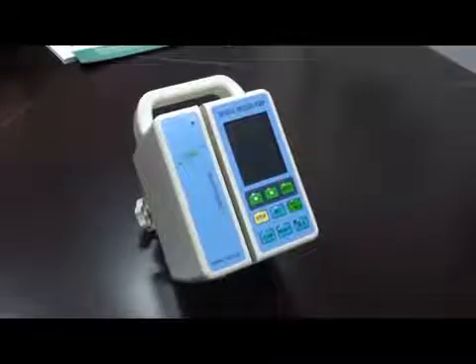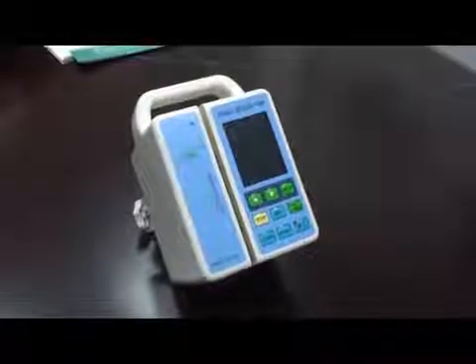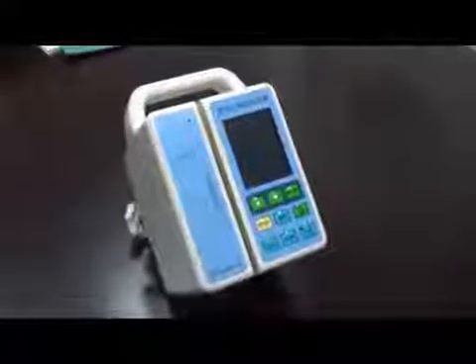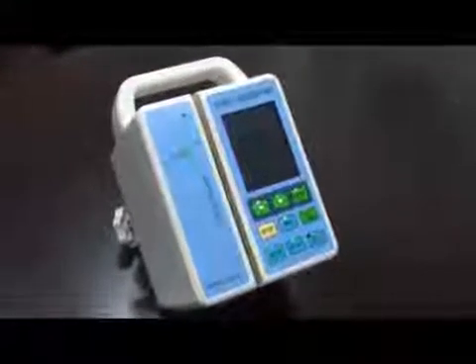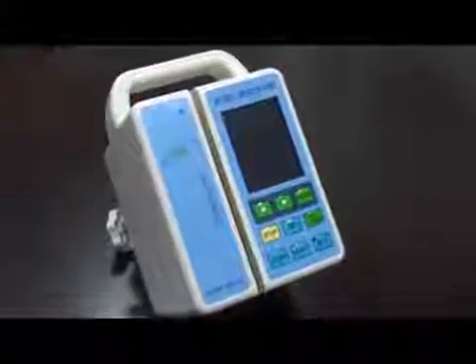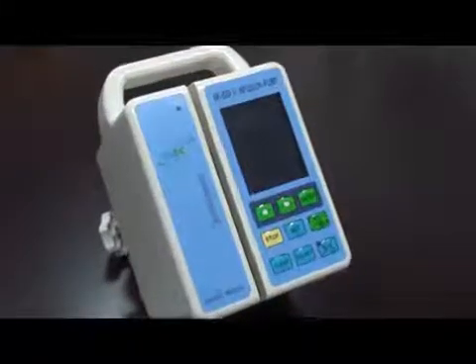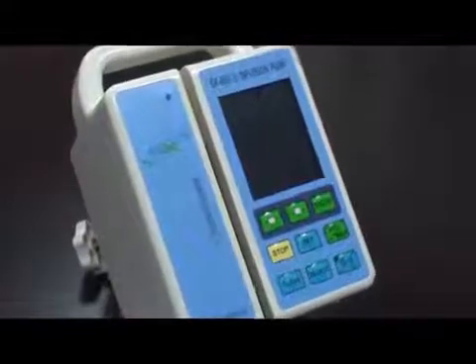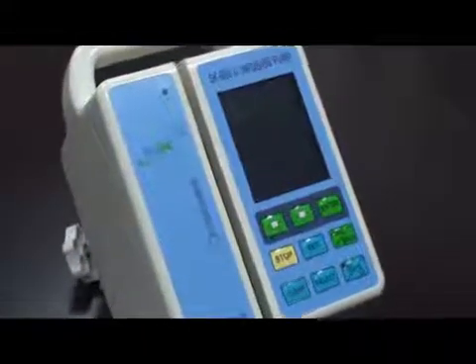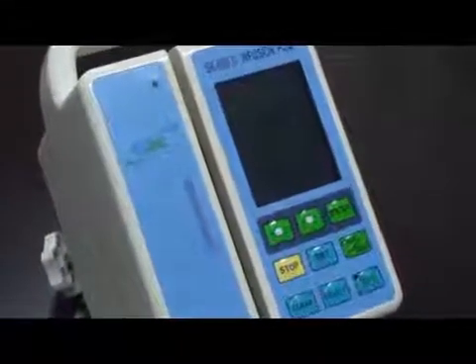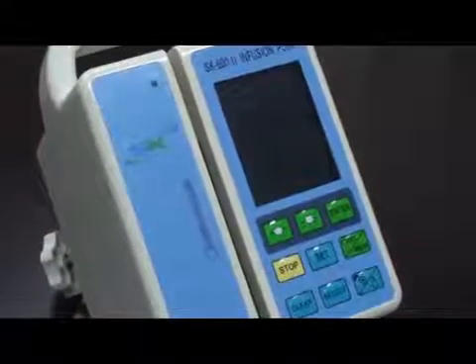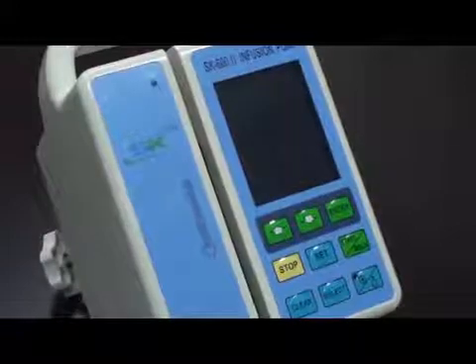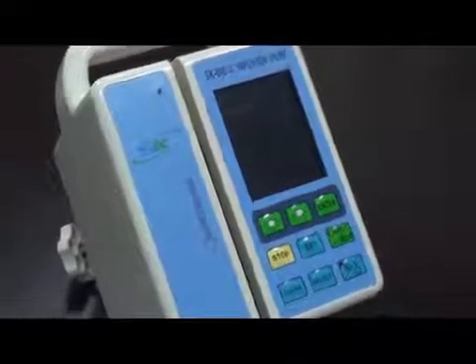Thank you for using the SK602 infusion pump. In this video, I'm going to show you two things: one, the basic operation steps of SK602; and two, if you want to change a new IV set, how to adjust the accuracy value.